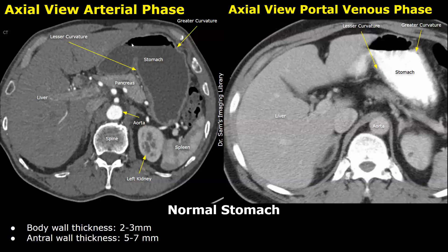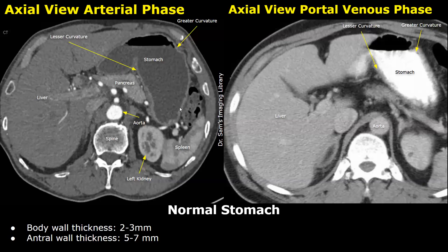Water is used as a neutral oral contrast agent. The stomach lumen appears darker or hypodense. It helps to distend the stomach without introducing artificial density, making it easier to visualize the stomach's inner lining and differentiate it from the surrounding tissues. The gastric folds or rugae may be visible, particularly in the body and antrum of the stomach.